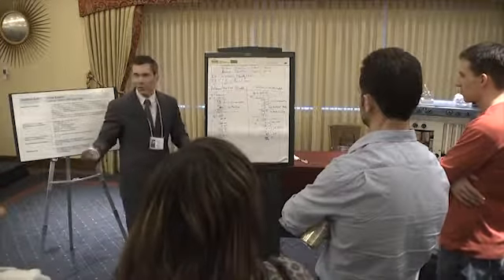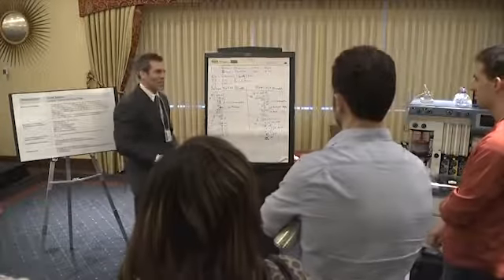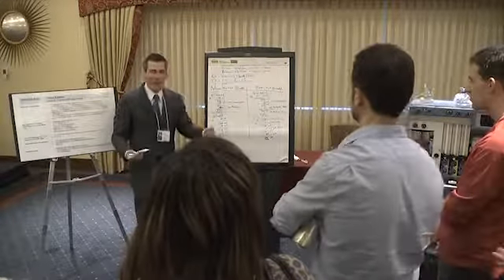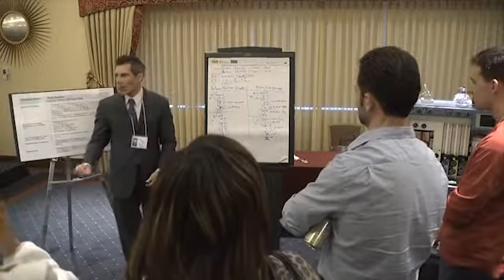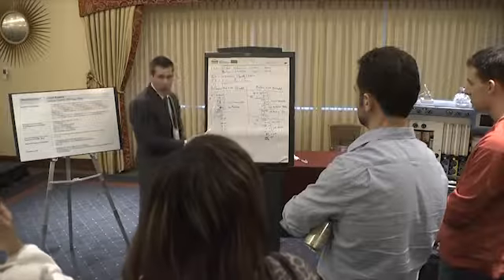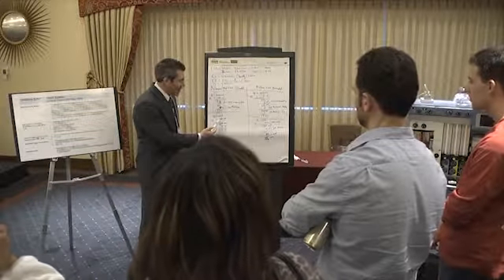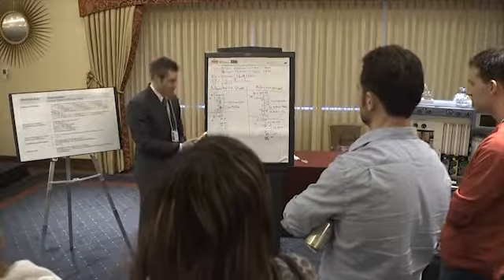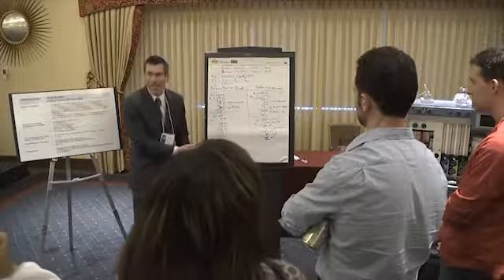Now, just to show you, well, why isn't this more of a problem? They've been using these machines for 60 some odd years. What's the problem? Well, if you do it at a lower fresh gas flow rate, so if you do a patient with the same exact parameters, but at 2 liters a minute, the 2 liters is only going to add 66 mLs to the system, and when you do all the same calculations, it's going to come out to 613. Not so bad.